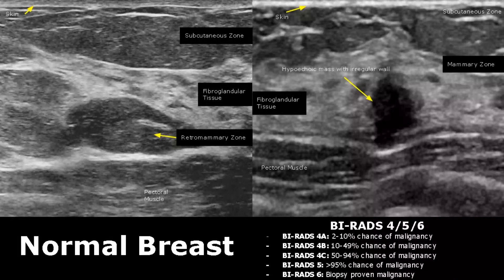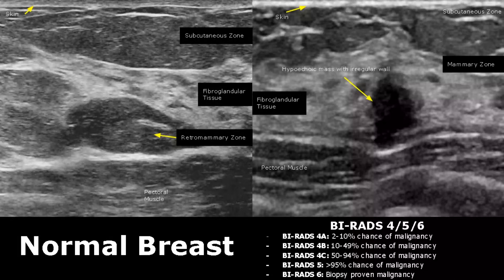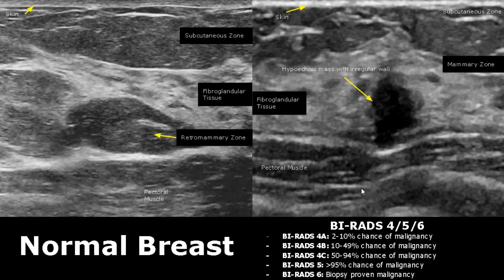Now we move on to BI-RADS categories which have a chance of malignancy. BI-RADS 4 has three subcategories: in 4A the chance of malignancy is 2 to 10 percent, 4B is 10 to 49 percent, and 4C is 50 to 94 percent. BI-RADS 5 has greater than 95 percent chance of malignancy, and BI-RADS 6 is a biopsy-proven malignancy.